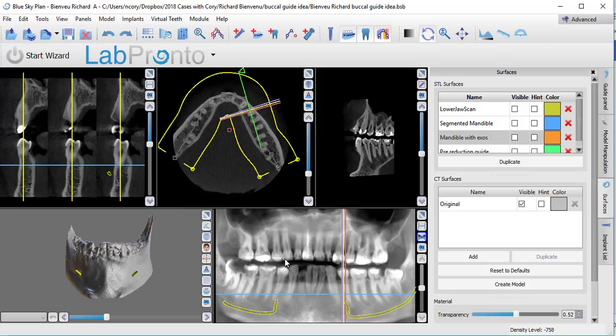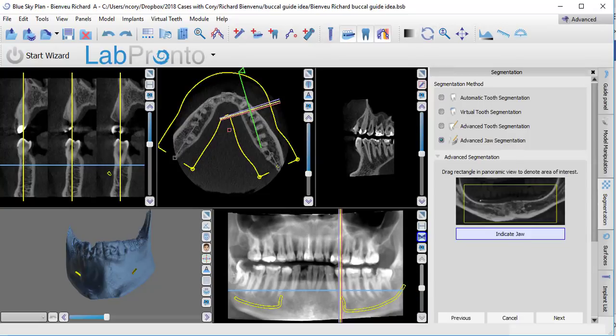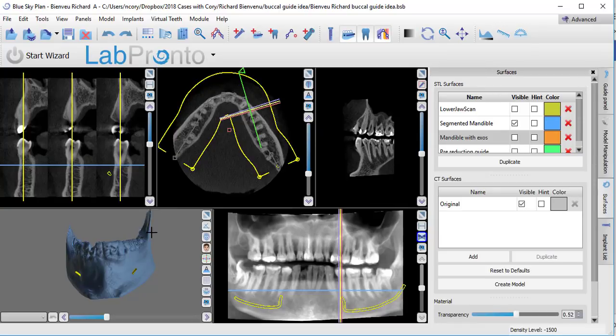As you can see, this patient is dentate, but it's a non-restorable dentition, so these teeth need to go, and what I'll be demonstrating in this video is just how I went about doing it on the mandible. With any kind of bone supported guide technique, the first step is that you have to segment the bone. If you go to panels, using the segmentation, you do advanced jaw segmentation. I would suggest going on my YouTube channel and looking up the video I have for this, because it can be a really tedious process, but I've got some hacks on there that show how to expedite that process, or alternatively you could just outsource this to Lab Pronto or to Image 3D Conversion. Both of those services do a nice job and will help you get a good result.